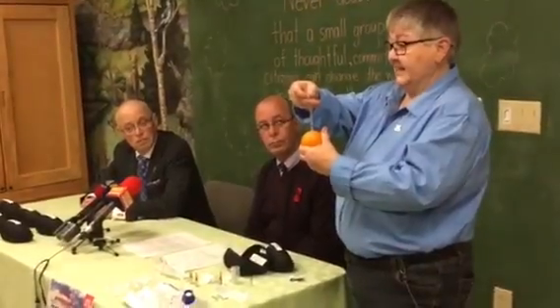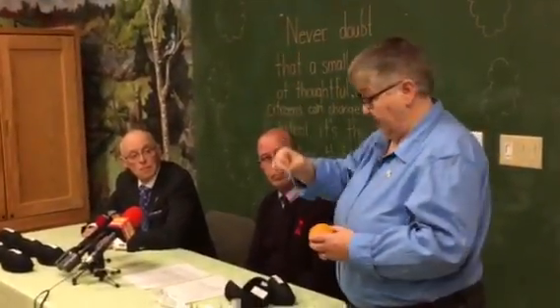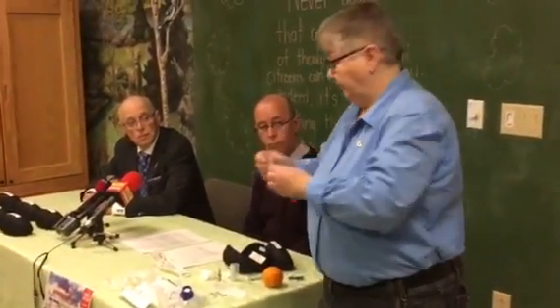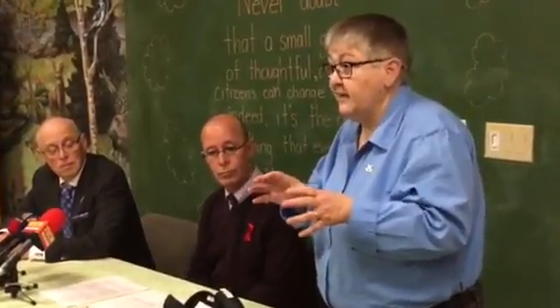There was a little click at the end of that. Ooh. And the needle has disappeared right up inside. You have to stay with the individual. The naloxone may not work for a few minutes. Usually in about 3 to 5 minutes, the person will start to wake up. If they don't, our kits have a second vial of naloxone. While you're waiting for them to come around, it's a good time to give them some more breaths. Maybe every 5 to 7 seconds, give the person a breath of air.